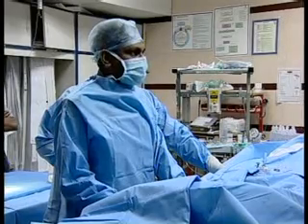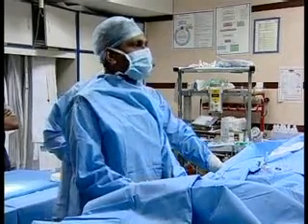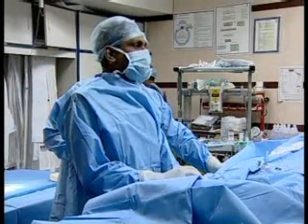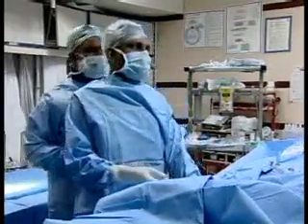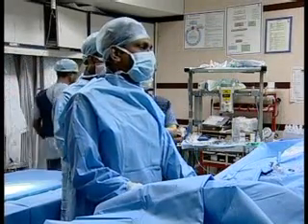But the Qp:Qs is apparently going to be high because clinically there is cardiomegaly, LV forces are high, and LVIDd Z-score is more than 1.8. The hemodynamic data is awaited, and we will tell you at the end of the procedure.